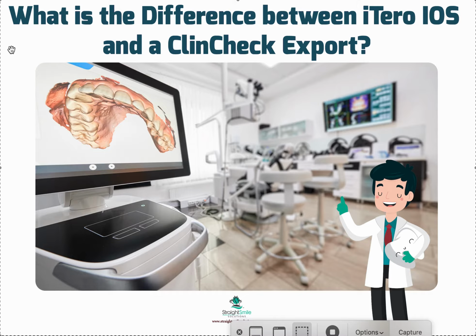And your doctor will take your feedback. You know, I don't love the way tooth number 10 looks. I'd like it a little more rotated, or can the teeth come a little more out, or can they go a little more back? They even have a facial recognition feature where they can put the teeth on your smile and you can see what it looks like. It's really sophisticated and it's really cool. And a really good doctor will want your feedback on the ClinCheck. They will want to know what you think, and they will want to know if you have concerns.